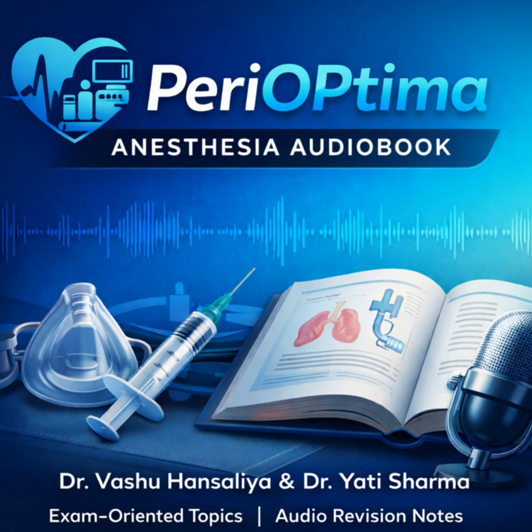Next, what is the Chandy maneuver and why is it performed? It's the two-step process used with the LMA. Gentle handle rotation for optimal ventilation, followed by a slight forward lift without tilting to align the ETT axis and lift the epiglottis bar. What are the specific seal pressures of the LMA Classic and the ProSeal? 20 and 30 centimeter H2O, respectively. You have to be precise with those numbers.